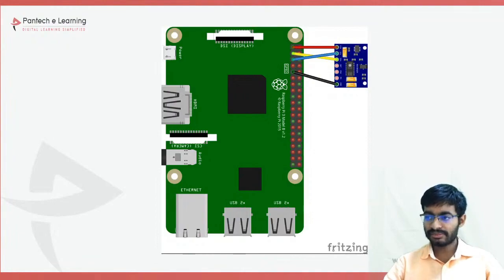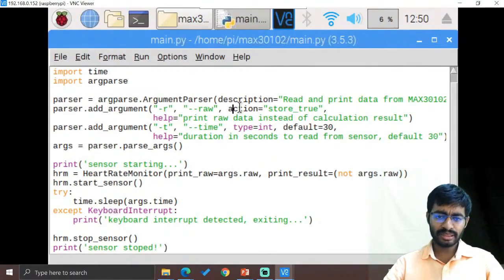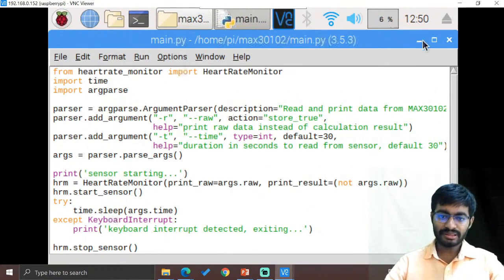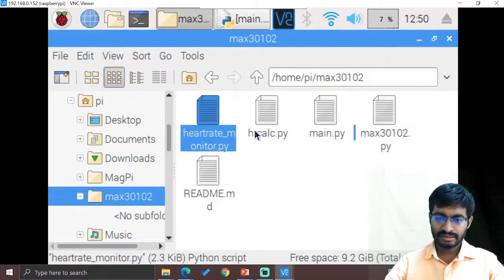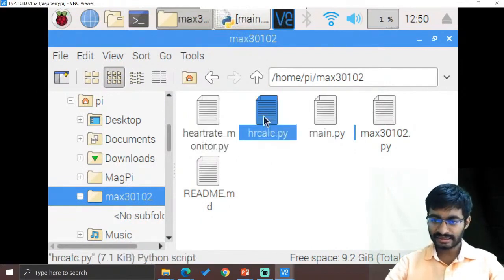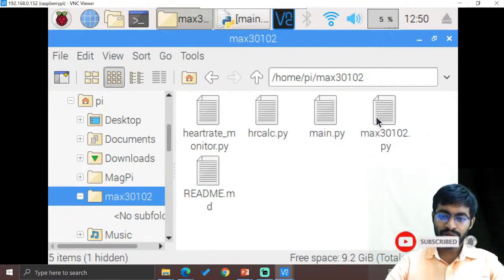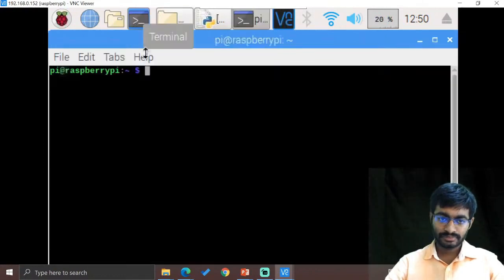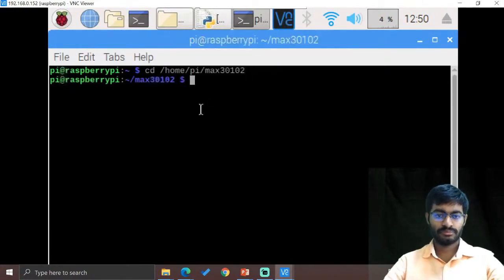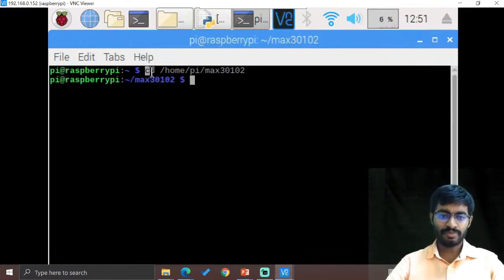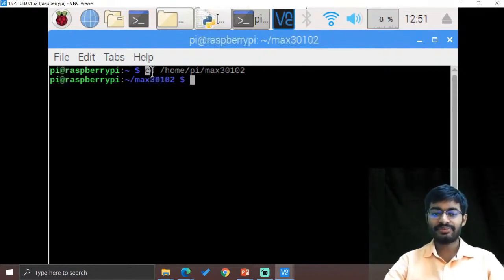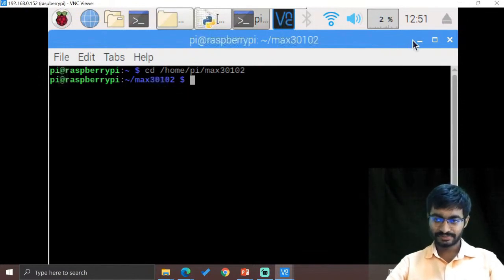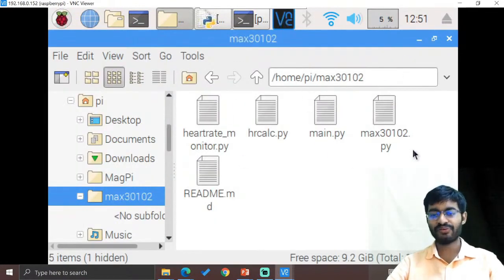Now let us go for the coding part. Here we have some library files for this particular coding, like heart rate monitor, HR calculation (HR means heart rate calculation), and max30102.py — all the I2C integrations will be provided there. Let us access this through the terminal. We access the terminal using the 'cd' command — cd is known as change directory. Those who have worked under Linux, this is very simple. I have pasted the required path to access the folder.